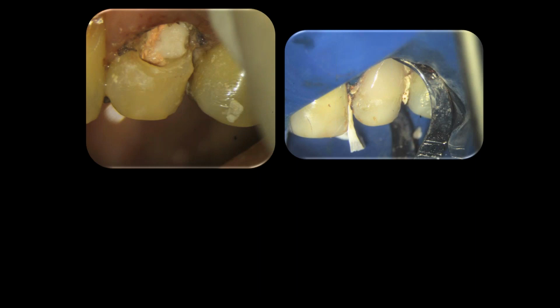This is a very old case. Now, since I'm addressing mainly the beginners and first-time users, I thought that you should see that once upon a time, my isolation, documentation, etc. were not that great. It wasn't that clean or effective to look at, but it served the purpose and it was absolutely functional. So here is an example of a premolar with a class 5 deep caries lesion where I have performed the root canal through the caries lesion, and after that the gingival margin has been trimmed, following which I have performed the rubber dam isolation, packed the margin with Teflon, and completed the post root canal direct composite restoration.